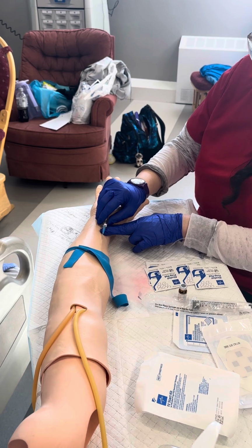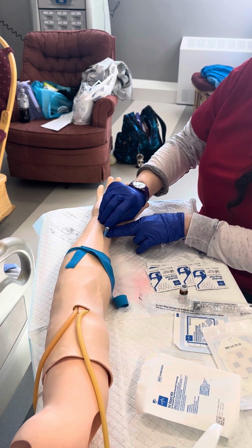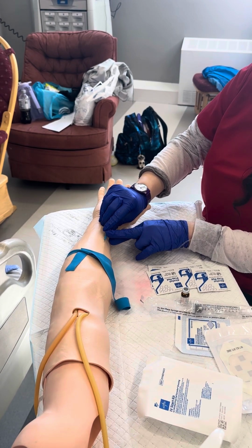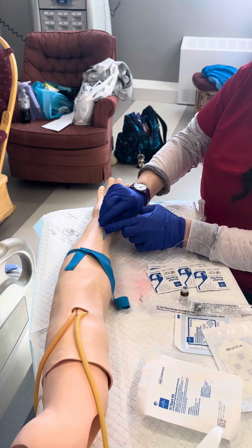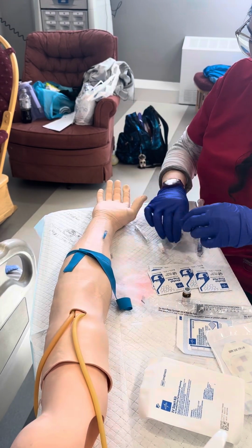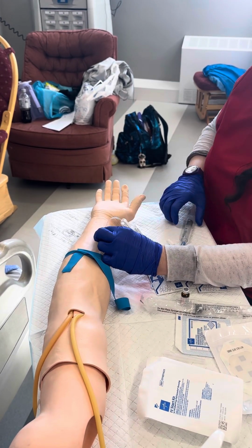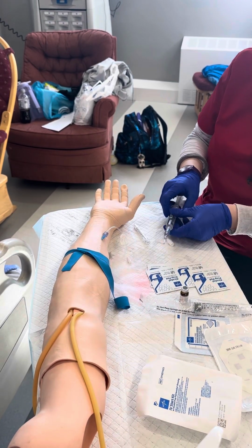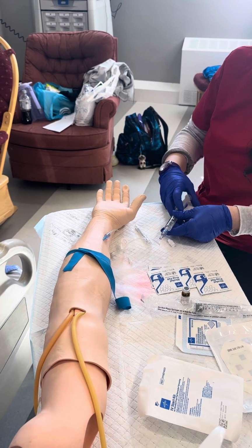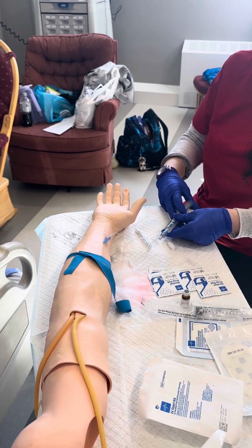There's the blood return, advance a little bit more. There's that. I'm going to look for blood return. Pretty good. All right, I'm going to go ahead and flush for about a minute.